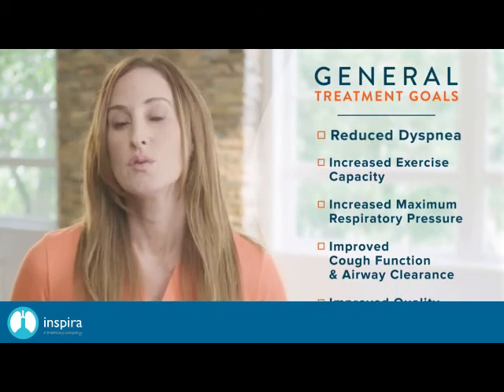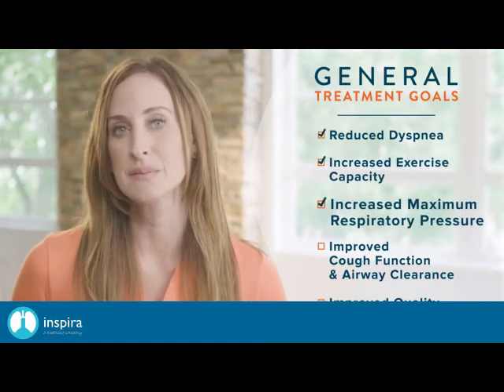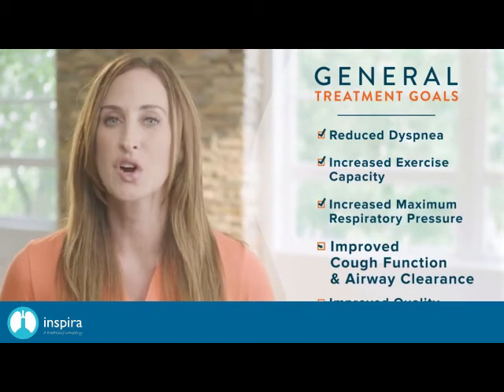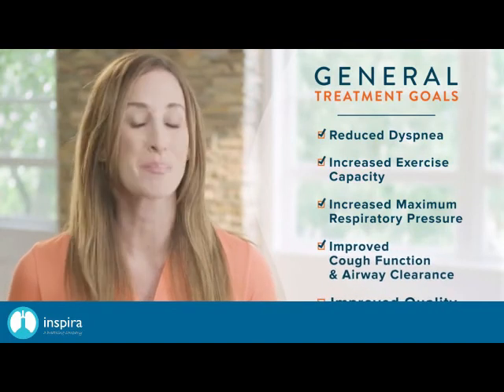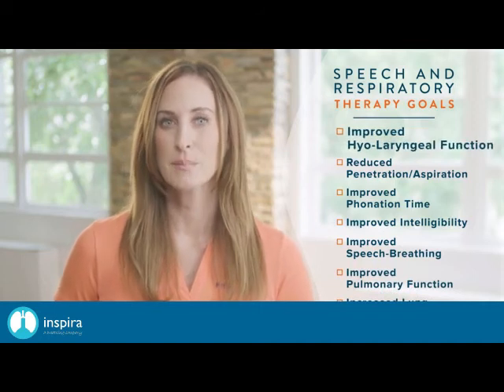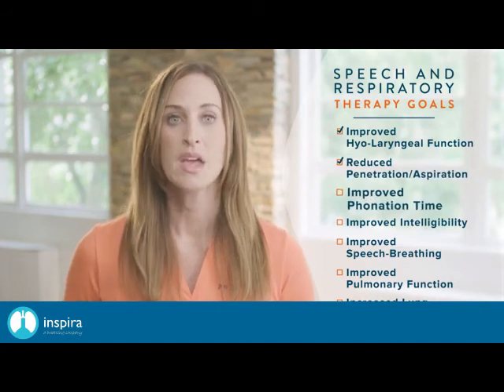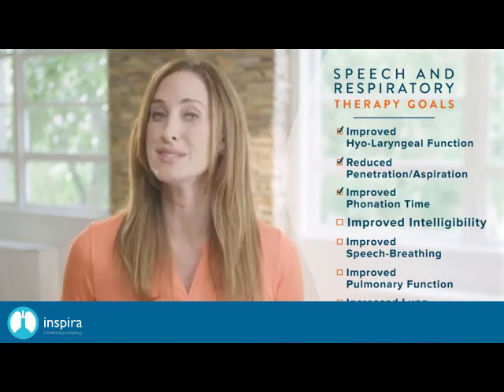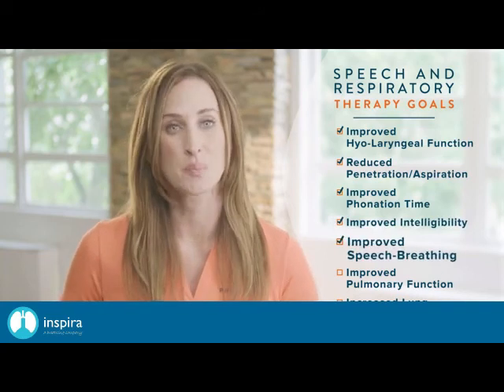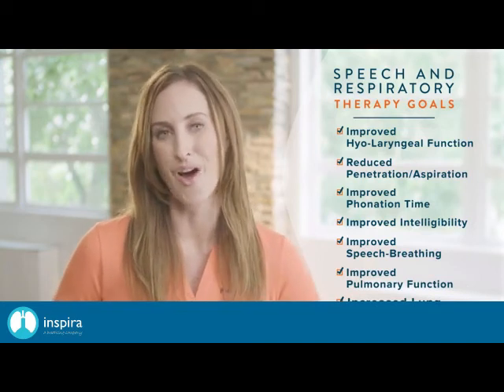Achievement of treatment goals can be expected after about 4 weeks of RMT. General treatment goals include reduced dyspnea, increased exercise capacity, increased maximum respiratory pressure, improved cough function and airway clearance, improved quality of life. Speech and respiratory therapy goals include improved hyolaryngeal function, reduced penetration aspiration, improved phonation time, improved intelligibility, improved speech breathing, improved pulmonary function, increased lung capacity and volume.